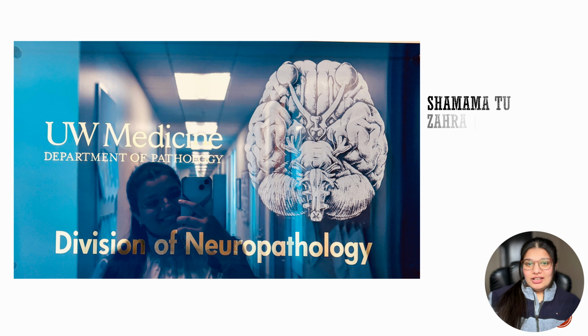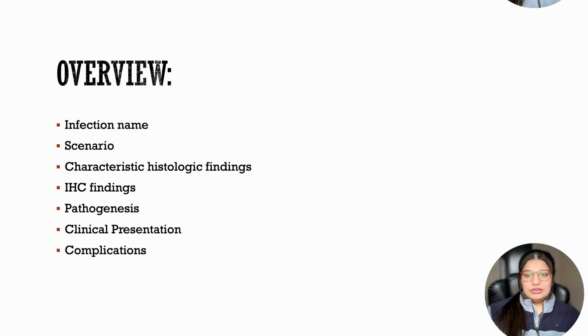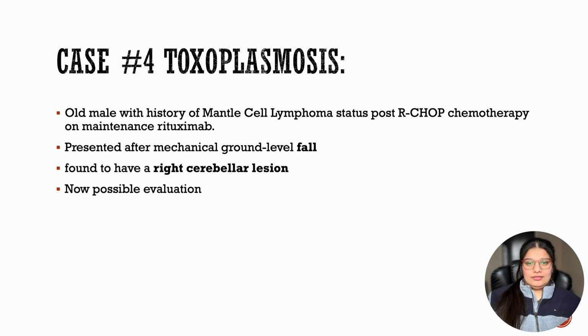This was my presentation during my rotation in the neuropathology department at University of Washington. These are the overview points we will discuss in this video. This is the fourth video from our series of infections, and the topic of today would be toxoplasmosis. It's basically caused by Toxoplasma gondii. So let's start with the scenario.